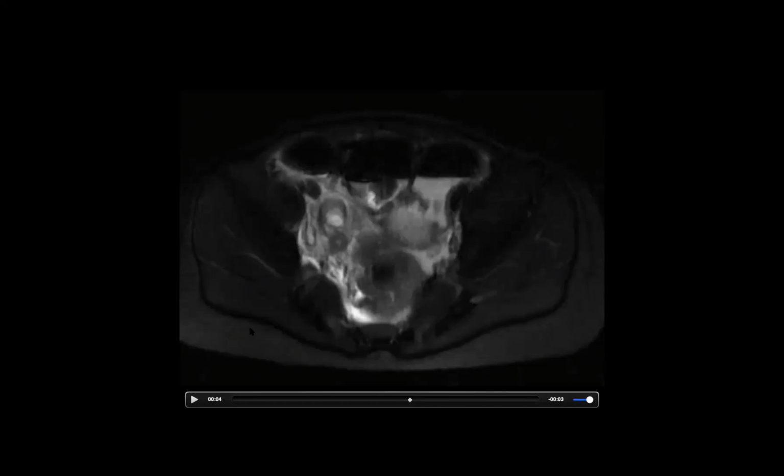I don't know, Shiraz. You shouldn't see any shift in the phase encoding direction. Well, you do see it with EPI sequences, right? Between fat and water. But this is a spin echo, a fast spin echo. Yeah. So then, what's accounting for this?